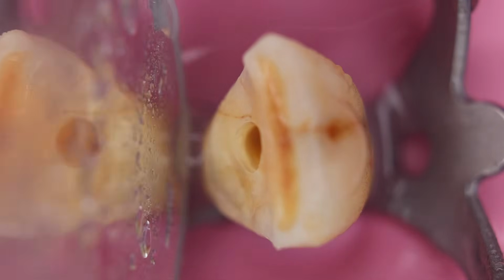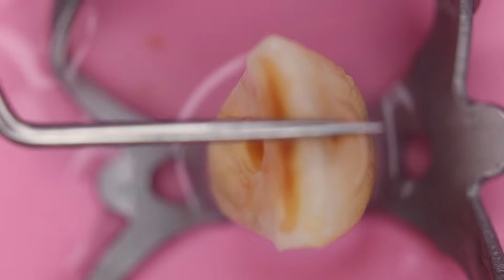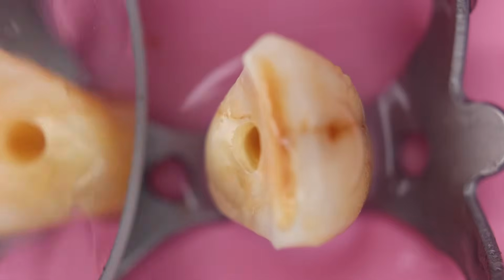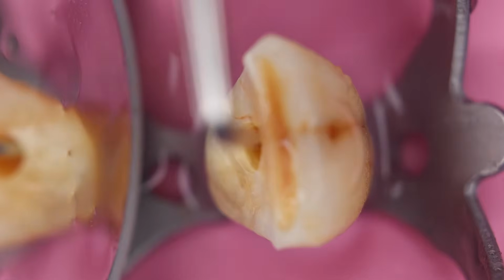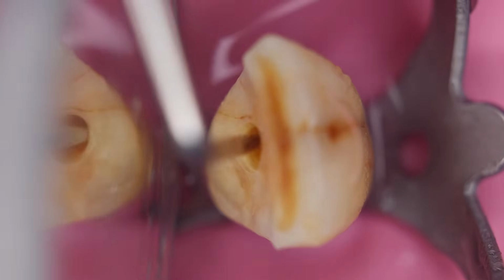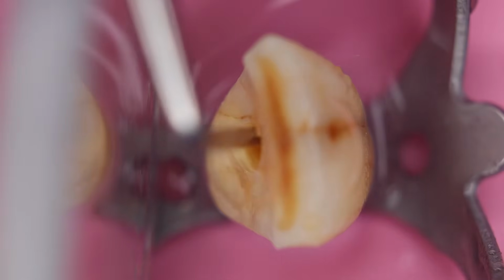So now you can use the DG16 probe over here. This is the DG16 probe, and this probe can be used if you have just entered into the pulp chamber and you have got the burr drop. Slight de-roofing is still required. So now you have to approach it a little safely.